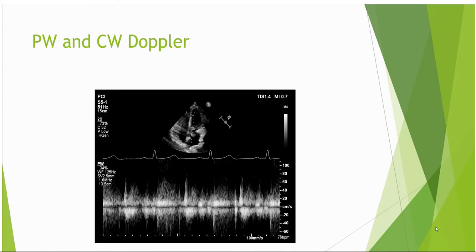Increasing the sample volume is used when attempting to gather low flow or stroke volumes, or when imaging deep in the patient and image quality is poorer, which also means Doppler information is lesser quality. In the example here, assessing a pulmonary vein, an inappropriately small volume has been applied, and incomplete flow profiles are seen throughout the spectral trace.